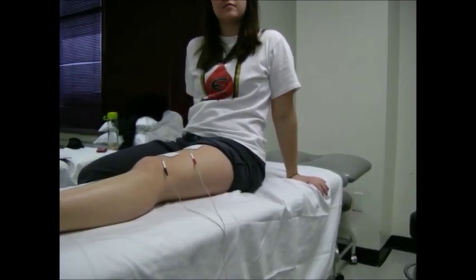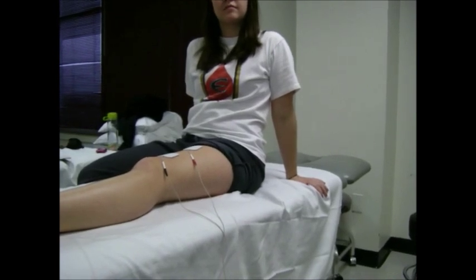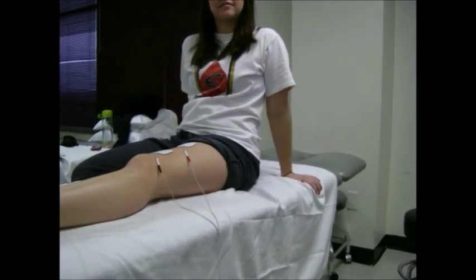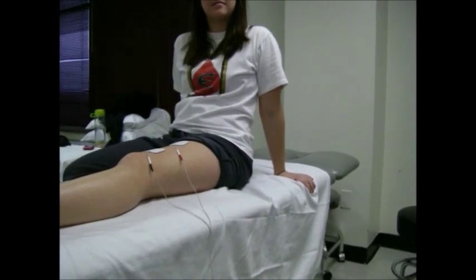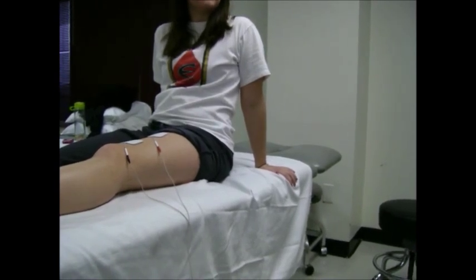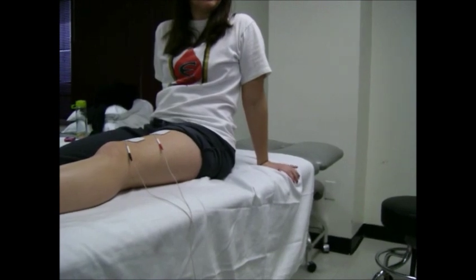That is going to be followed by 3 sets of 10 repetitions each with the maximum amount of current tolerable. A 2 minute rest separated the sets. During the 10 seconds on time, the current amplitude was adjusted to the maximum amount the patient was able to tolerate. On our last 3 sets, the patient was encouraged to contract the quadriceps femoris muscle group as the current was delivered.